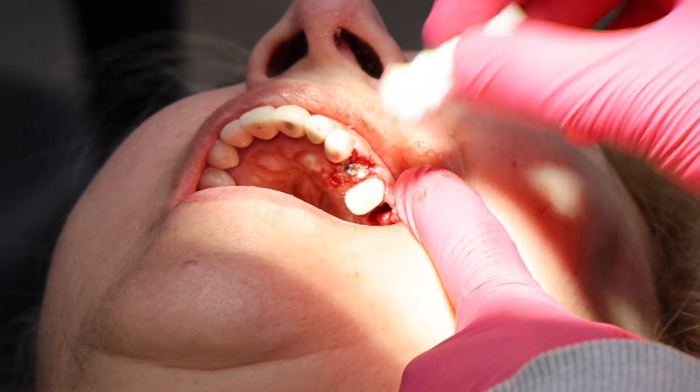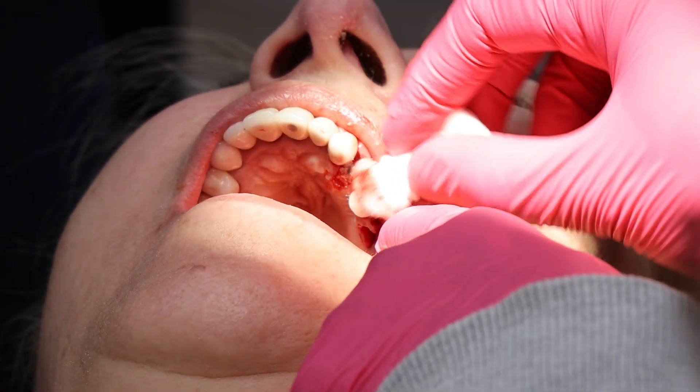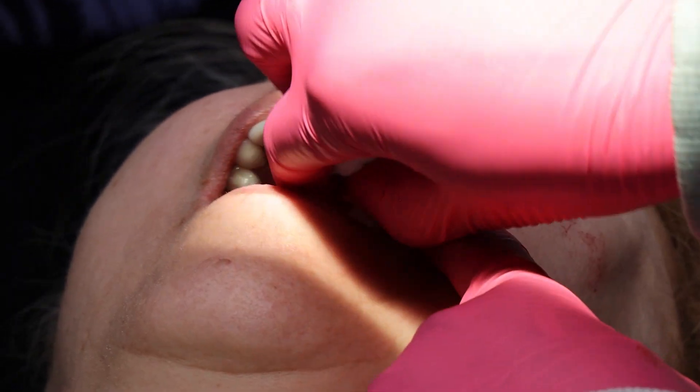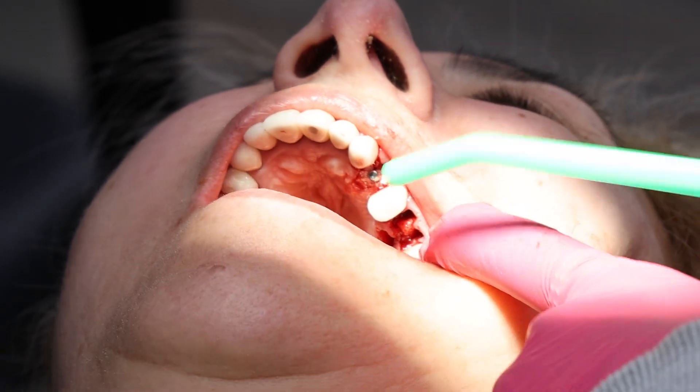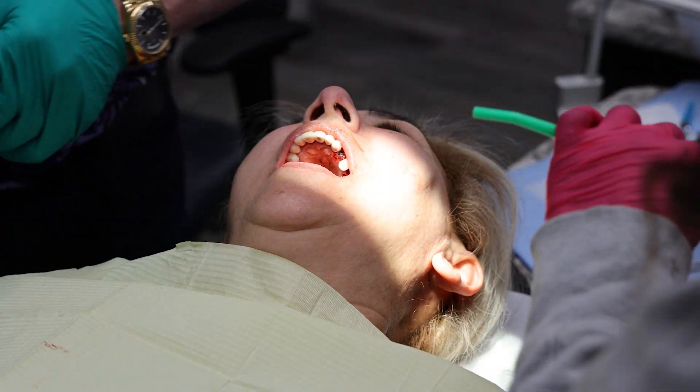We'll go ahead and do the other two implants now. Teeth are out and one of the implants is already done.